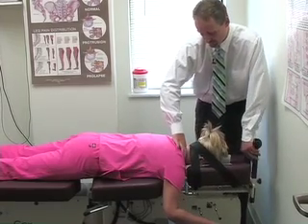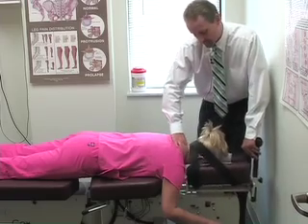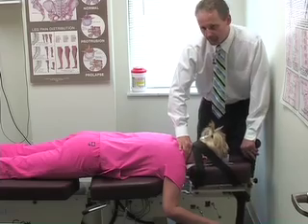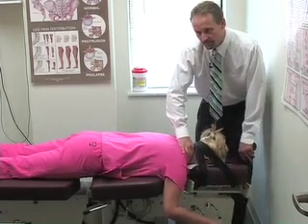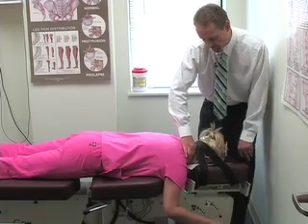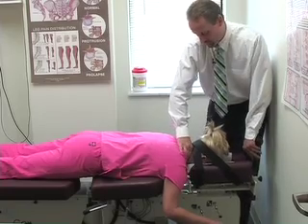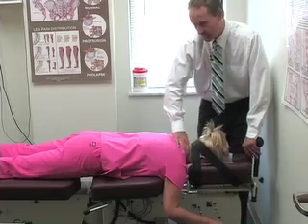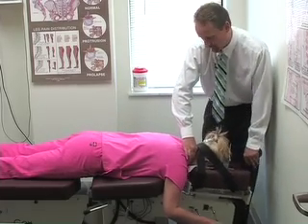And then for patients who, for whatever reason, prefer not to have a manual manipulation of the cervical spine, this is very effective for your standard biomechanical neck pain or facet irritation. Also cervicogenic headaches originating from facet irritation in the upper cervical spine. It's very comfortable for patients, very well tolerated. Even patients with advanced degenerative changes that are very tender in the cervical spine really enjoy this treatment.